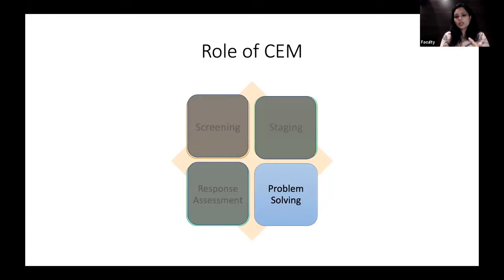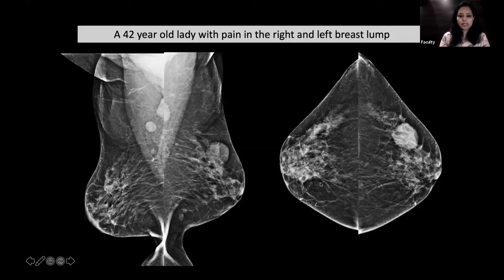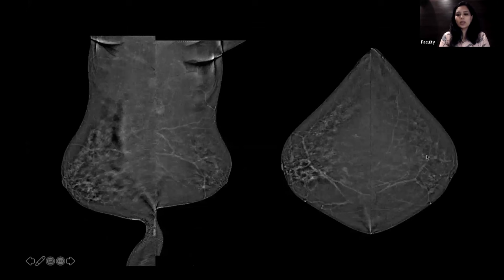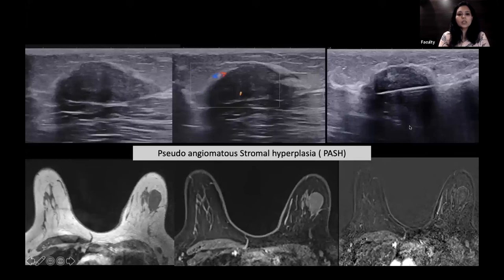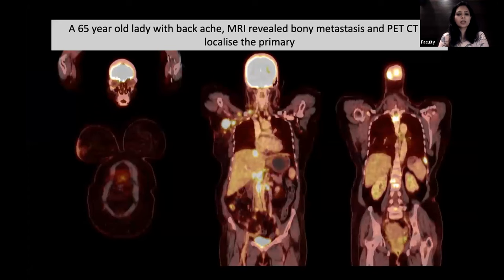CEM can also be used as a problem-solving tool. A 42-year-old presented with right breast pain and a left breast lump present for two to three years. The right breast showed periductal mastitis; the left had a large, palpable, circumscribed solid mass. However, there was absolutely no enhancement of this left mass. Final biopsy was pseudoangiomatous stromal hyperplasia (PASH). The absence of enhancement confirmed this large solid mass could not represent an invasive cancer.